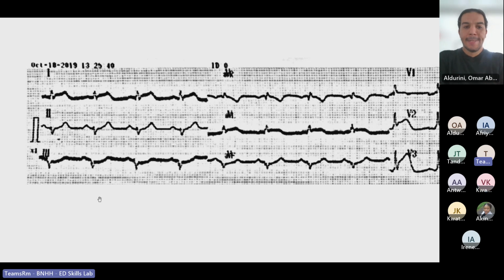And then in lead 2, nothing. Let me have a look at the other side. Nothing that I can see from my end.